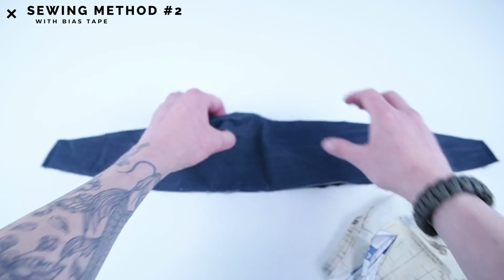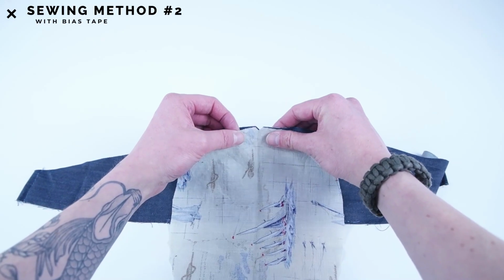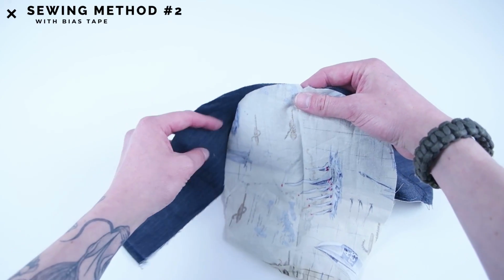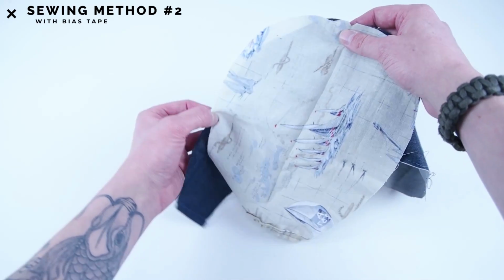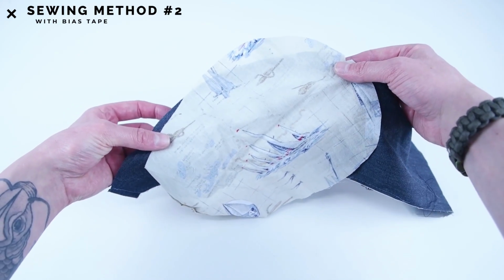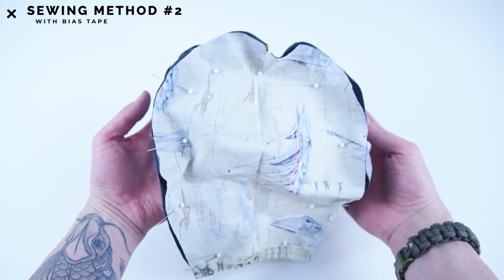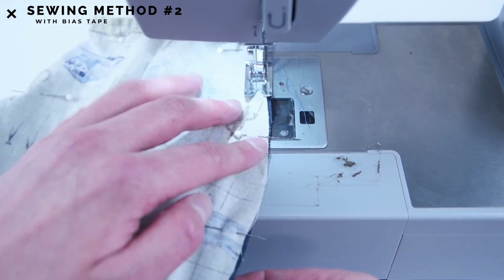Grab your top main panel and your side main panel, and what we're going to do is line up the notches and pin all the way around the outside edge. And the easiest way to do this is start from the middle notch and pin towards the left side and then pin back towards the right side. And once you have it all pinned down, we're going to sew at a 1/4 inch seam allowance around the outside edge.